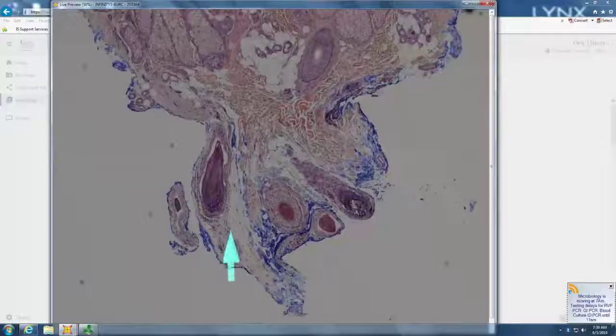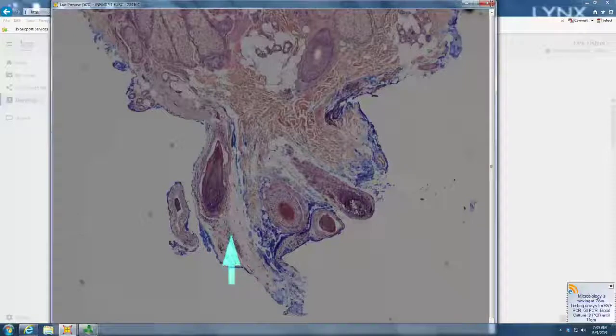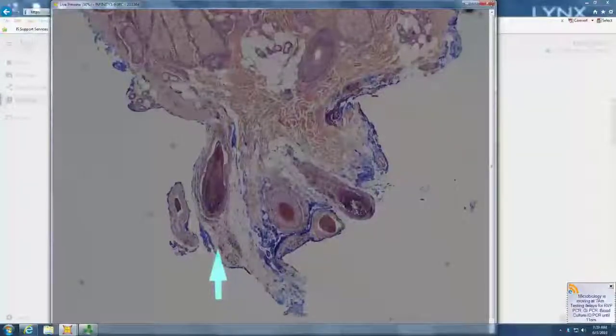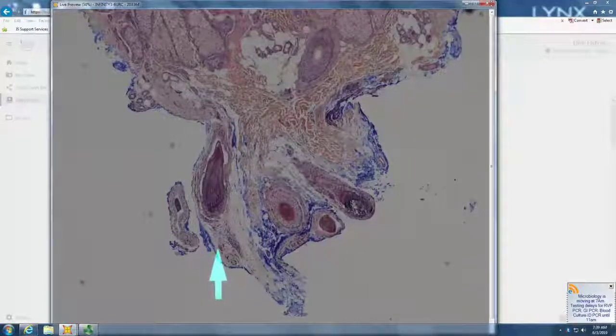Additional features of alopecia areata and syphilis: lymphs around the bulb that, as the bulb retreats upward, become lymphs in the fibrous tract, pigment in the fibrous tract left over from the attack at the hair bulb, and sometimes eosinophils in the fibrous tract.